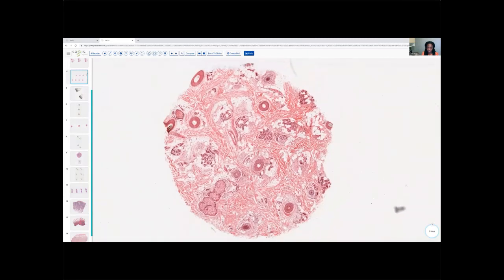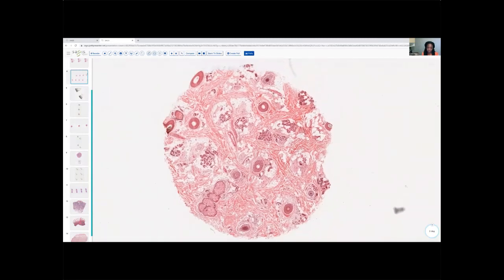Well, what that means is we're seeing the follicles at different levels, which means therefore that there's been some sort of movement upwards of our hair follicle. Essentially, we have had miniaturization. So the point here is that the best place to look for miniaturization is in the bulbar, but particularly the suprabulbar zone. That's where you're going to really identify this variation in the size of the follicles, and that's abnormal.